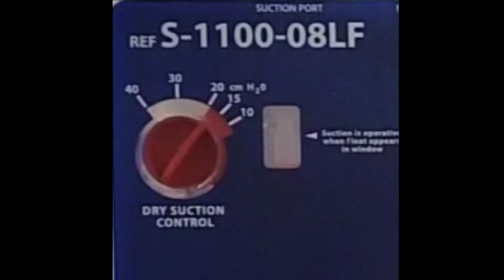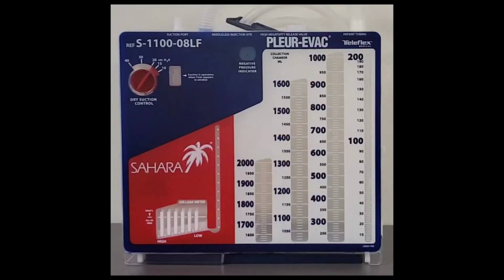Let's just say the wall regulator is set at 10, but the device is supposed to be at 20. You're only going to get 10 because the main vacuum is only at 10. This is why you want the wall set to at least what the device should be, or even greater, but never less than.